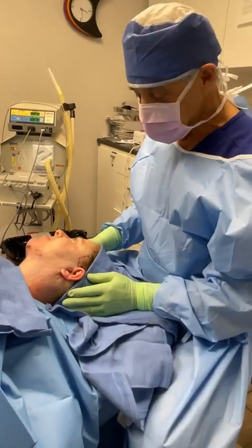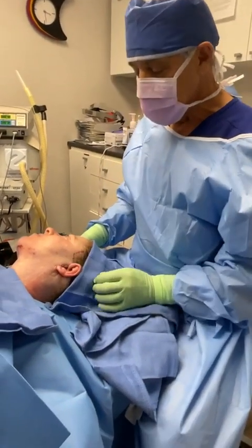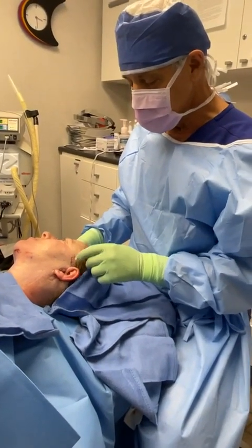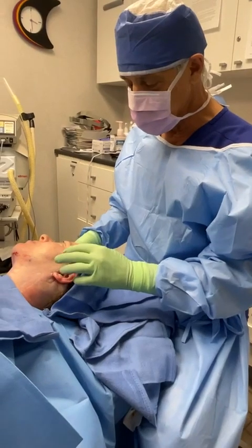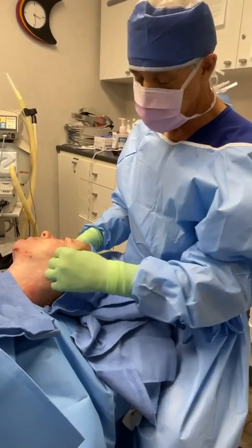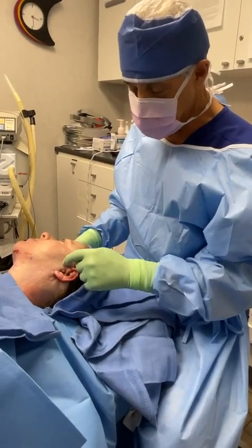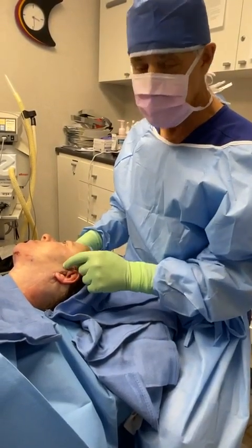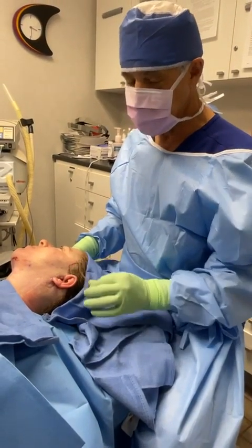First me. And so you can see there are some tiny little stitches in here. In general, I don't really like to remove hair, and it's always in my way when I do procedures, but she has long hair, and that hair is just going to cover this whole thing instantly. And plus, there's hair in front of and below this incision that I did trim a little bit so I could at least work some.